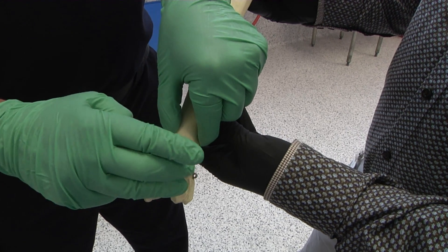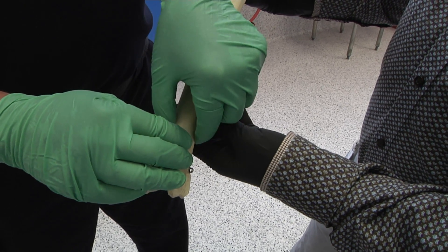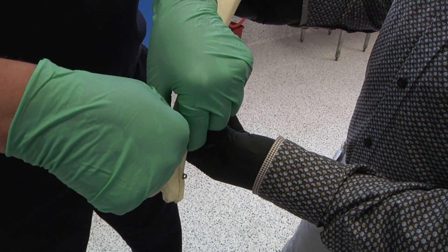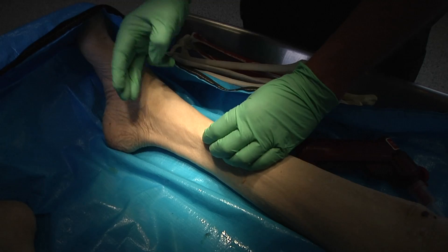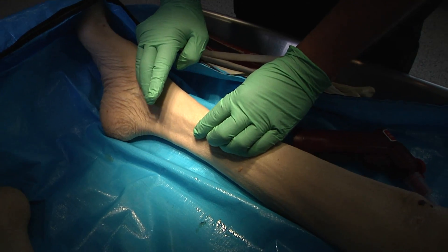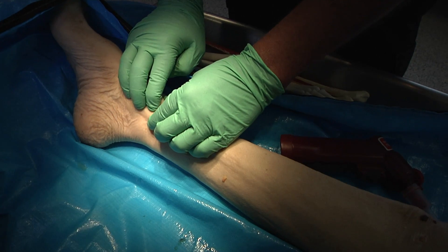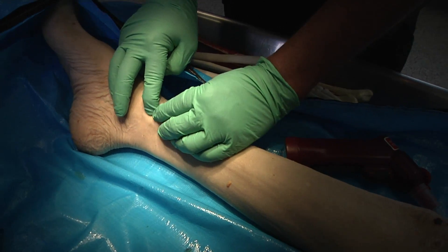Three fingers above the tip of the medial malleolus. We've identified the spot. We've already isolated the tibia, and that's your point of insertion. This is a procedure for establishing a distal tibial IO — remember, this is an alternative site. The three-finger technique: we put our ring finger or third finger on the tip of the medial malleolus, go three fingers up, isolate the tibia, and where my finger is, is our point of insertion.